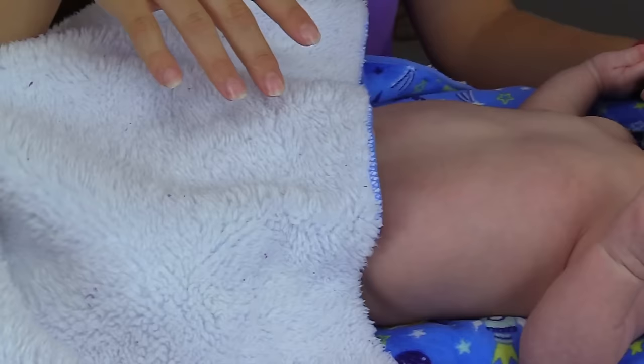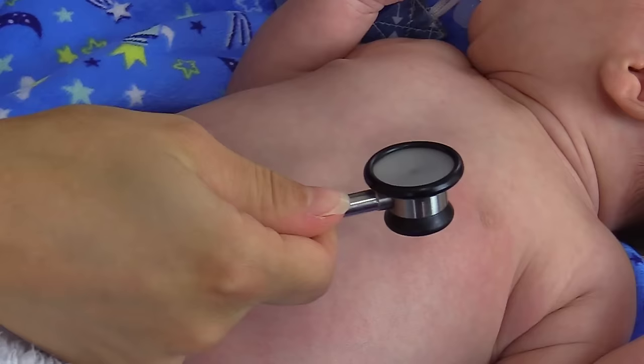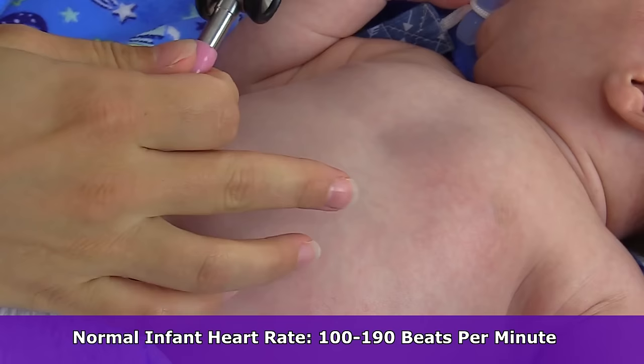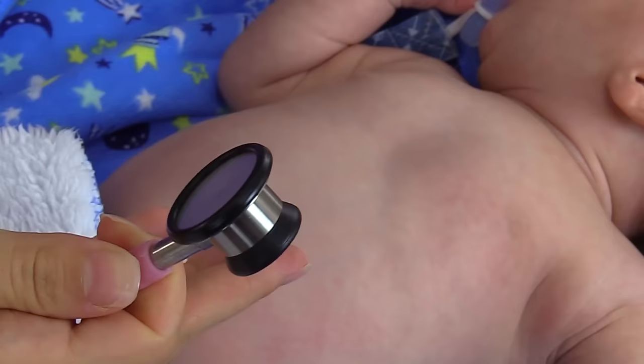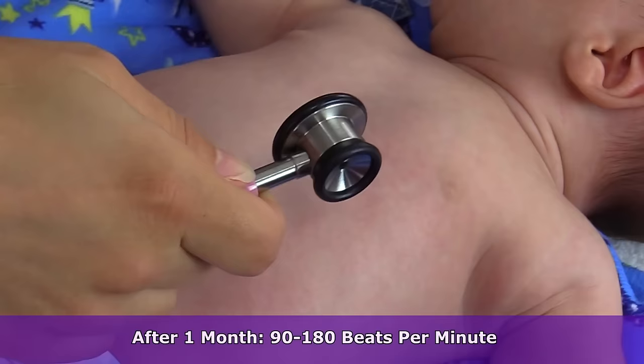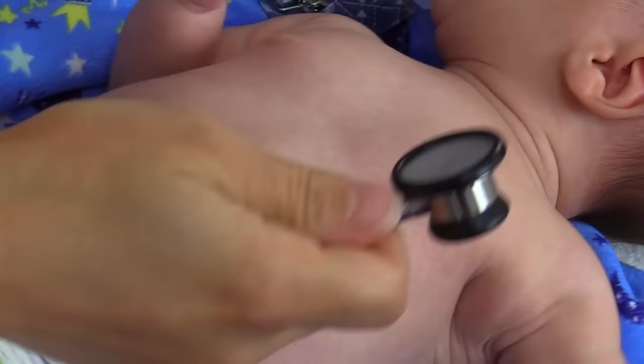To count the heart rate, you want to make sure you're using the appropriate size diaphragm and bell — we have an infant here so we're using an infant size. For an infant who is less than a month, a normal heart rate is about 100 to 190 beats per minute, and this can vary if the infant is crying or sleeping. If the infant is over one month, the normal range goes down a little bit to about 90 to 180 beats per minute. To count the heart rate, we're going to use the apical pulse, not the radial pulse like in adults.